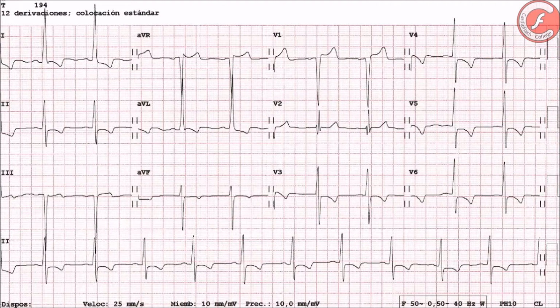However, apical hypertrophic cardiomyopathy deserves special attention as it tends to produce particular electrocardiographic abnormalities, for example, early high R waves in precordial leads and deep negative T waves in anterior leads.